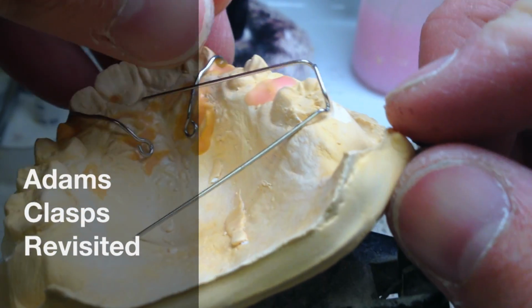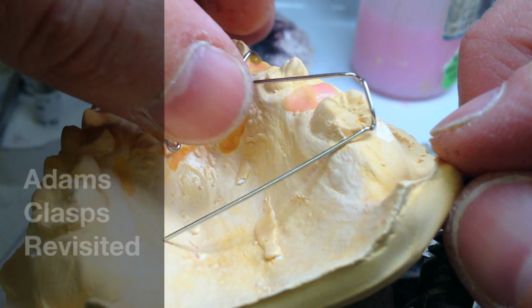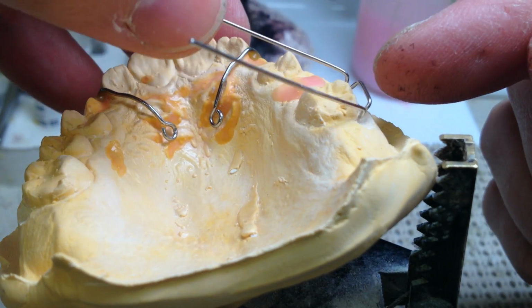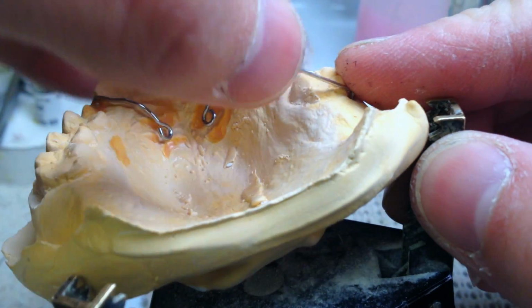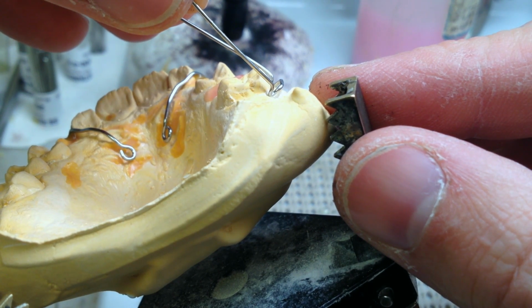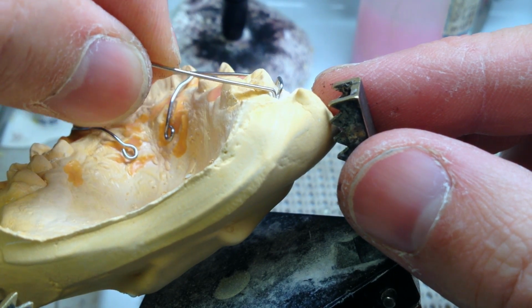Cade here. I've got a question on my YouTube page about Adam's clasp, and what they asked was the angulation of this bridge. It's always almost more than 45 degrees. It's almost perpendicular to the tooth. I assume she means like that. And how to correct that?